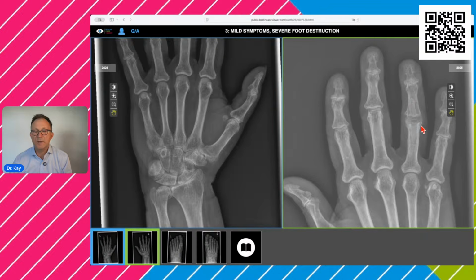That's done in patients with osteoarthritis or arthritis to maintain the alignment of the joint, and that's something orthopedic hand surgeons are ready to do. They drill holes into the bone, place these spikes in, and this is all one body made of silicone, and it bends a little bit, so it keeps the joint aligned.